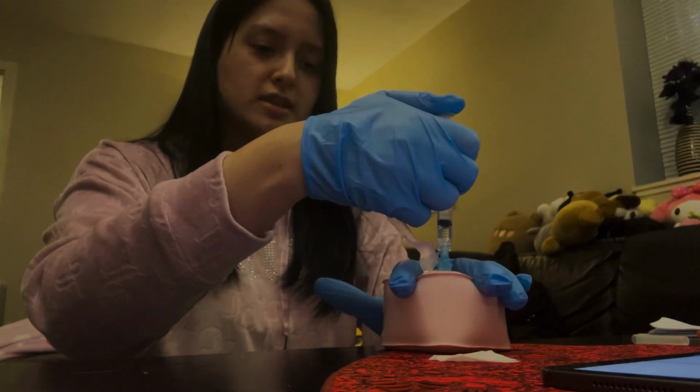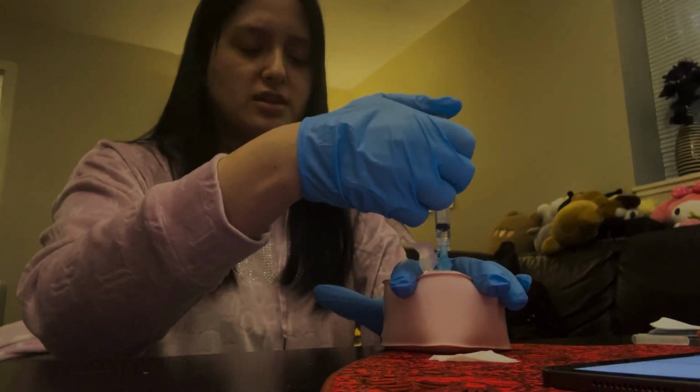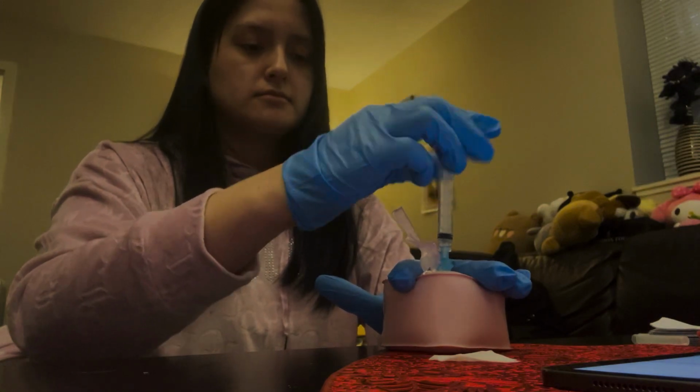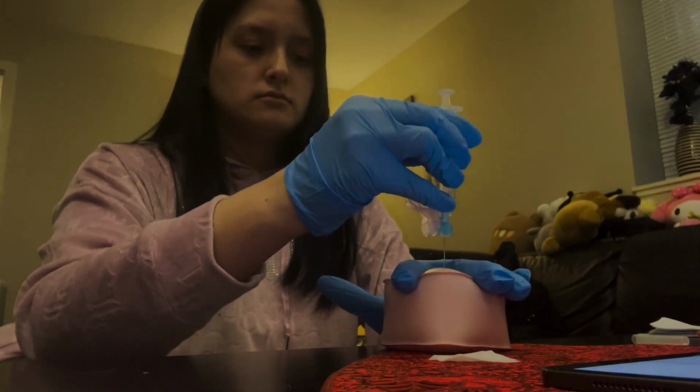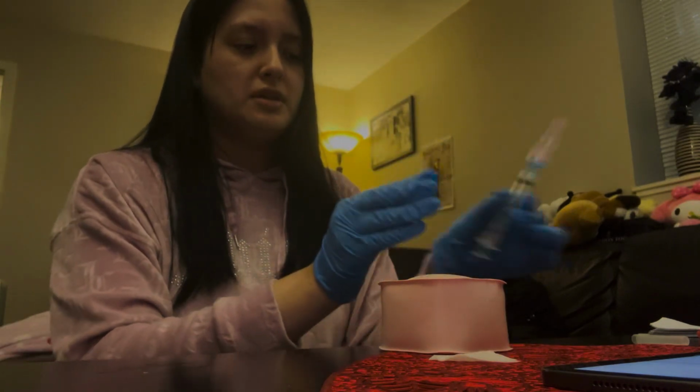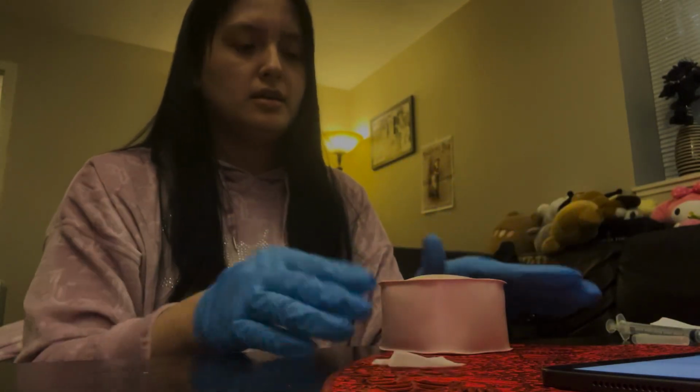It's important to make sure that you are looking and that you're aware of the patient if they're having any discomfort or anything. And I'm going to want to immediately cap the needle, put it to the side, and then swab the area with a gauze. I don't want to rub the area because it can cause skin inflammation and or bruising.